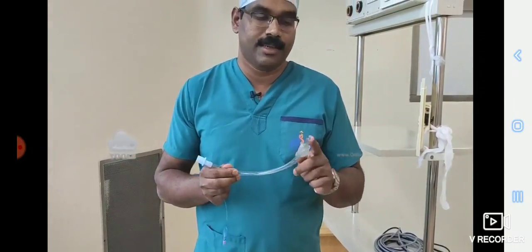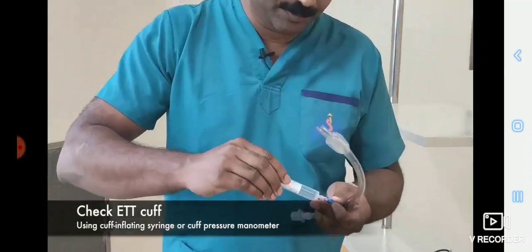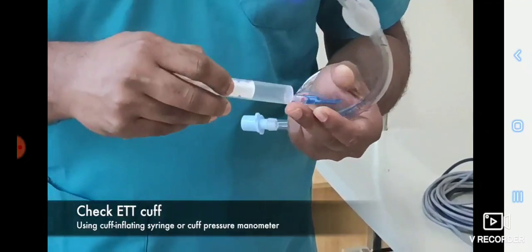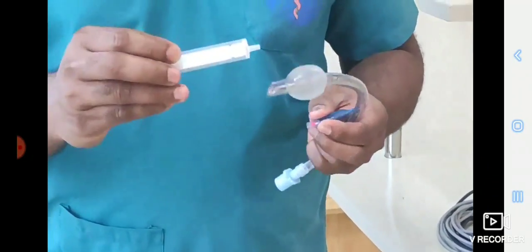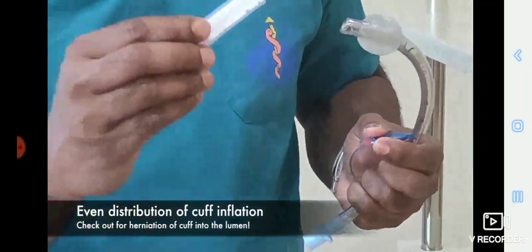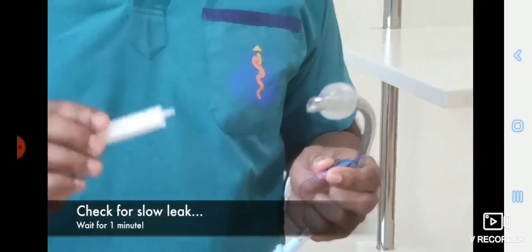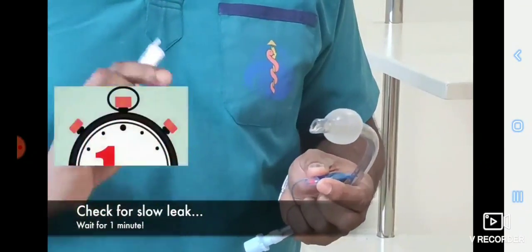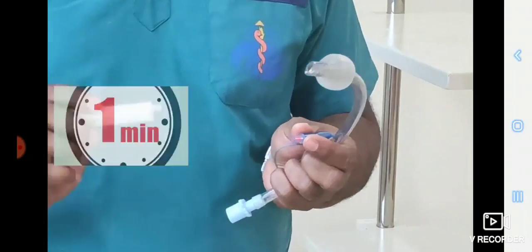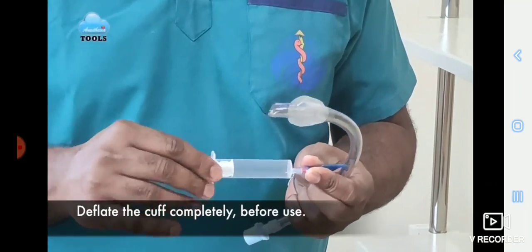Next step is to check the cuff. You can inflate the cuff with a cuff inflating syringe. You will be observing for even distribution of cuff inflation. Also, we have to see whether the cuff herniates into the lumen of the tube. Now, to check for a slow leak, keep it inflated for 1 minute. Remember, you have to disconnect the inflating syringe and wait for 1 minute. After 1 minute, if everything is fine, you keep the cuff completely deflated before use.